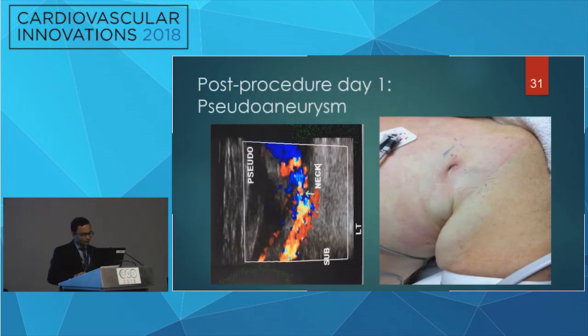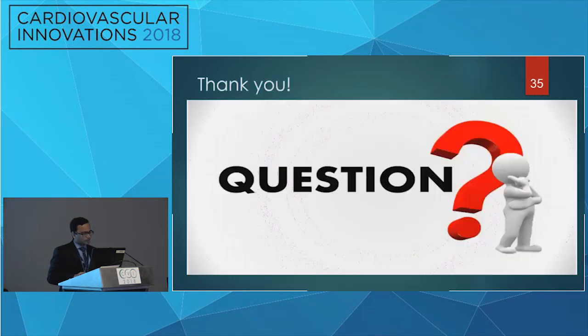You prevented, obviously, you solved a very complicated vascular complication, and hopefully over the long run should do relatively well. Obviously, we don't know the utilization of those centers was recently mentioned. We had a follow-up for this patient, who actually came back after a year for another follow-up, but there are no further complications, no signs of any ischemia going on, so hopefully it's patent.